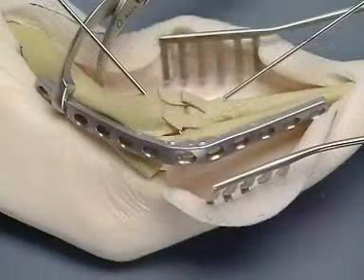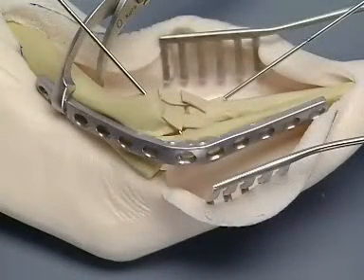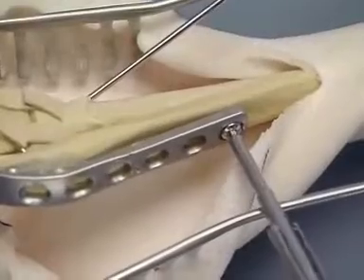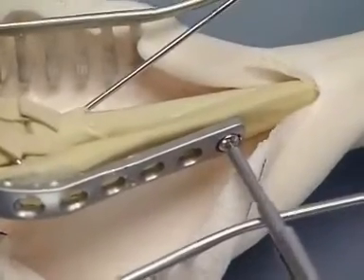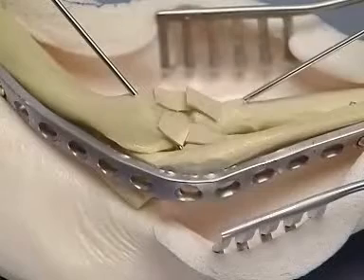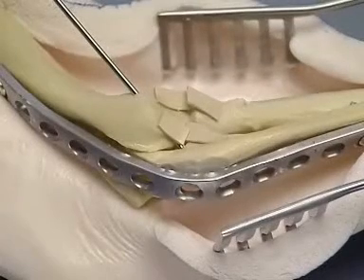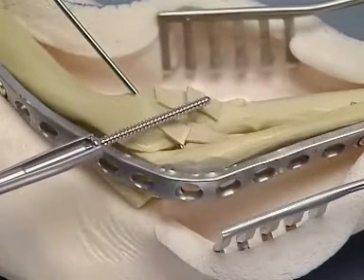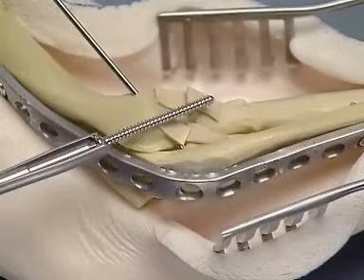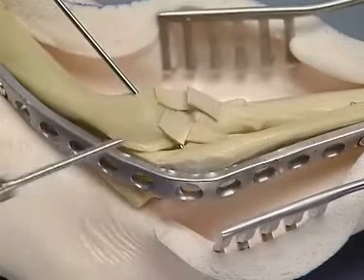A 12-hole 3.5 DCP is contoured to match the template. The plate is secured by first placing 3.5 millimeter screws in the most proximal and distal plate holes. The K wire is now removed if necessary. A 3.5 millimeter lag screw is placed through the plate and across the lateral portion of the humerocondyle into the radial head.